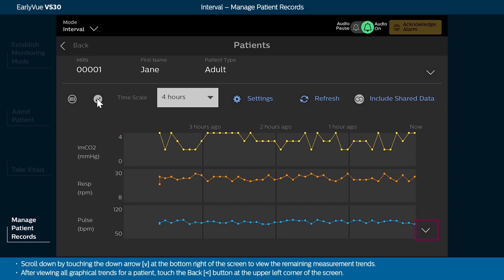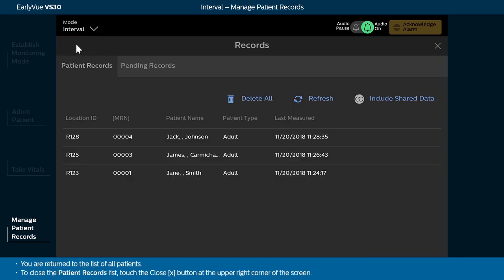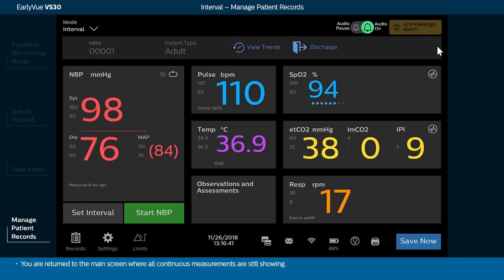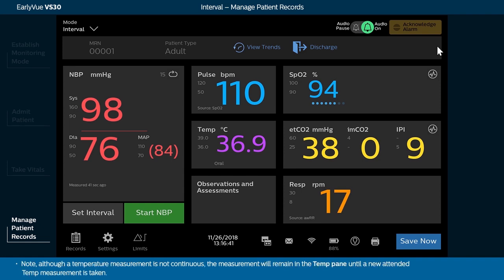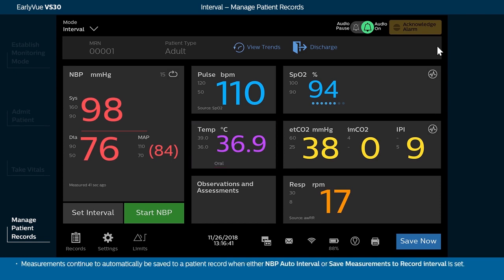Scroll down by touching the down arrow at the bottom right of the screen to view the remaining measurement trends. After viewing all graphical trends for a patient, touch the back button at the upper left corner of the screen. You are returned to the list of all patients. To close the patient records list, touch the close button at the upper right corner of the screen. You are returned to the main screen where all continuous measurements are still showing. Note, although a temperature measurement is not continuous, the measurement will remain in the TEMP pane until a new attended TEMP measurement is taken.